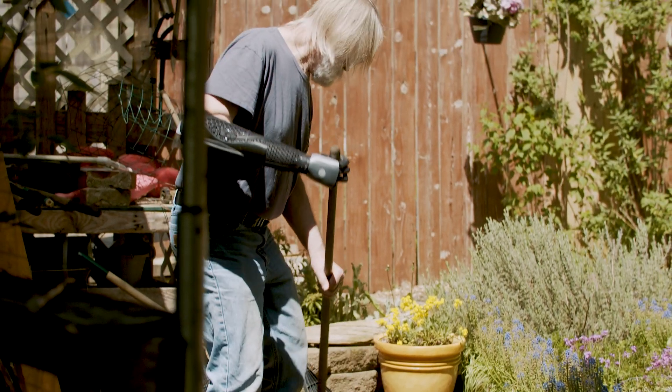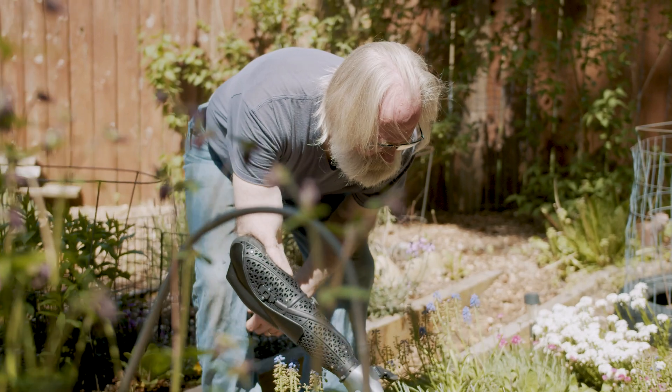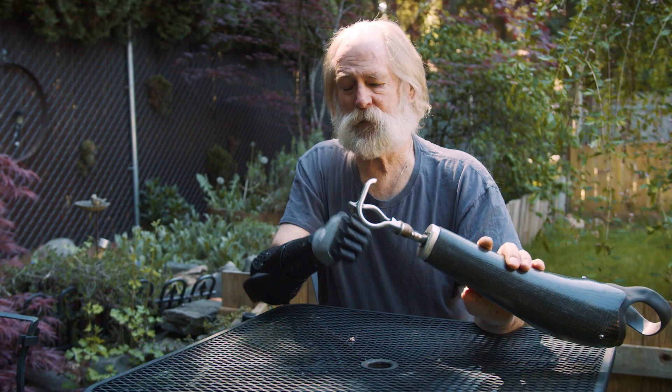With my Hero Arm, I could do all the normal stuff that a two-handed person can do. That's the biggest difference. That's what I've had for years and years. And when Hero Arm came about, it was like the difference between night and day.